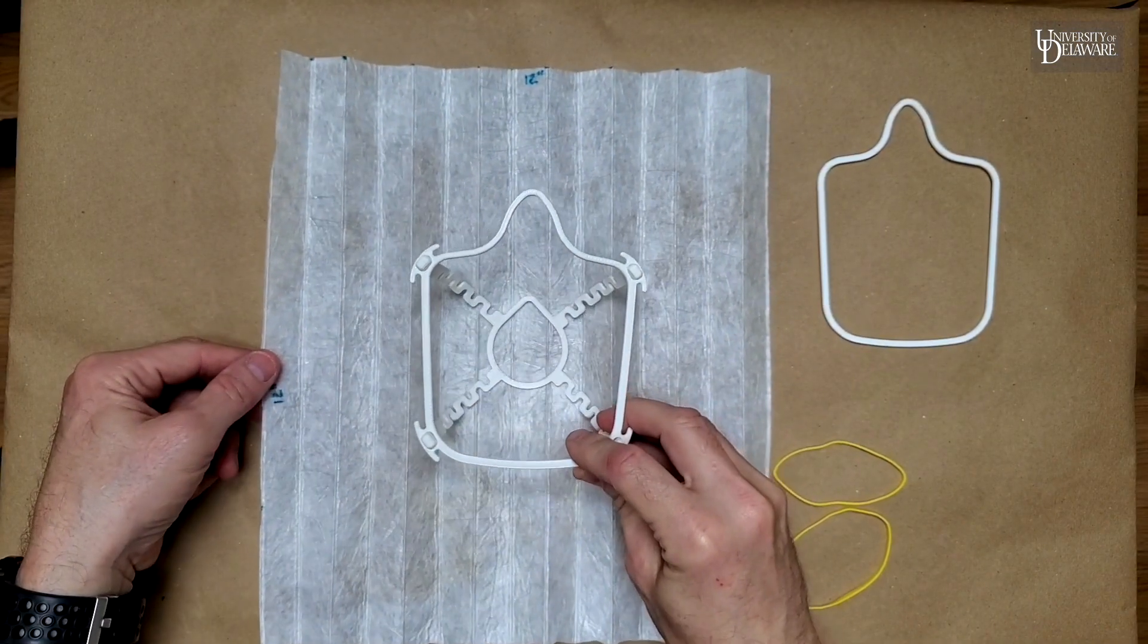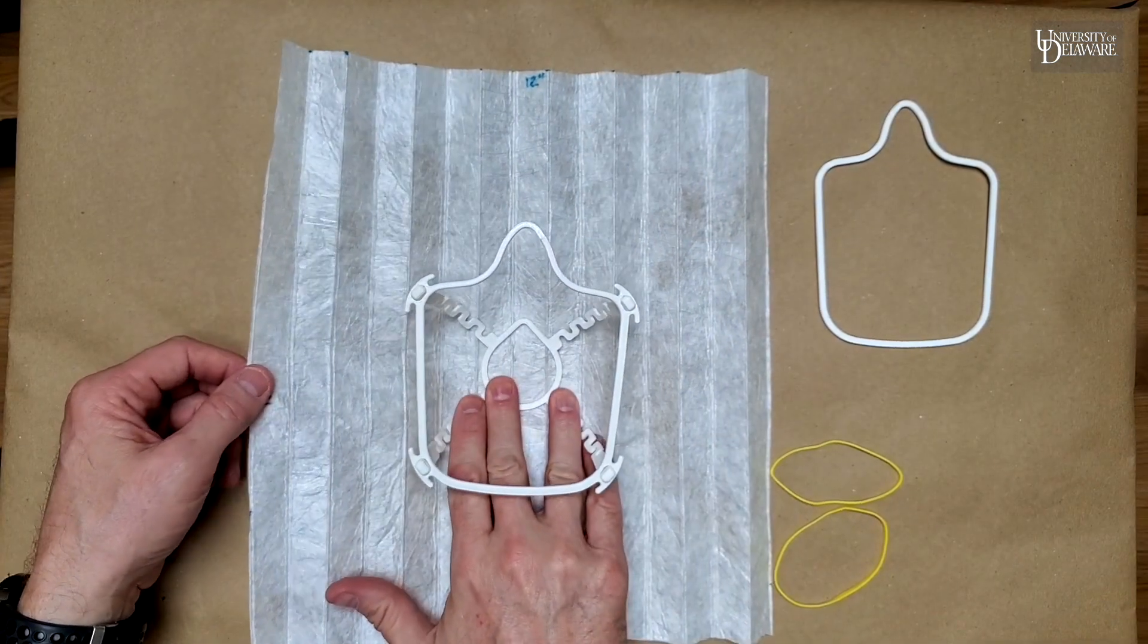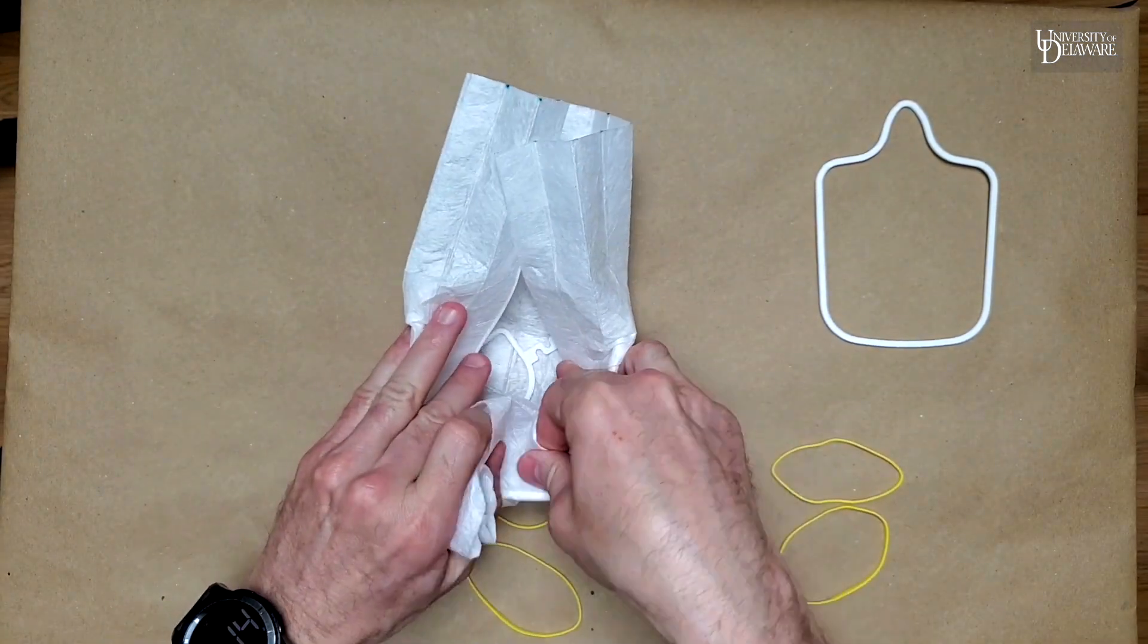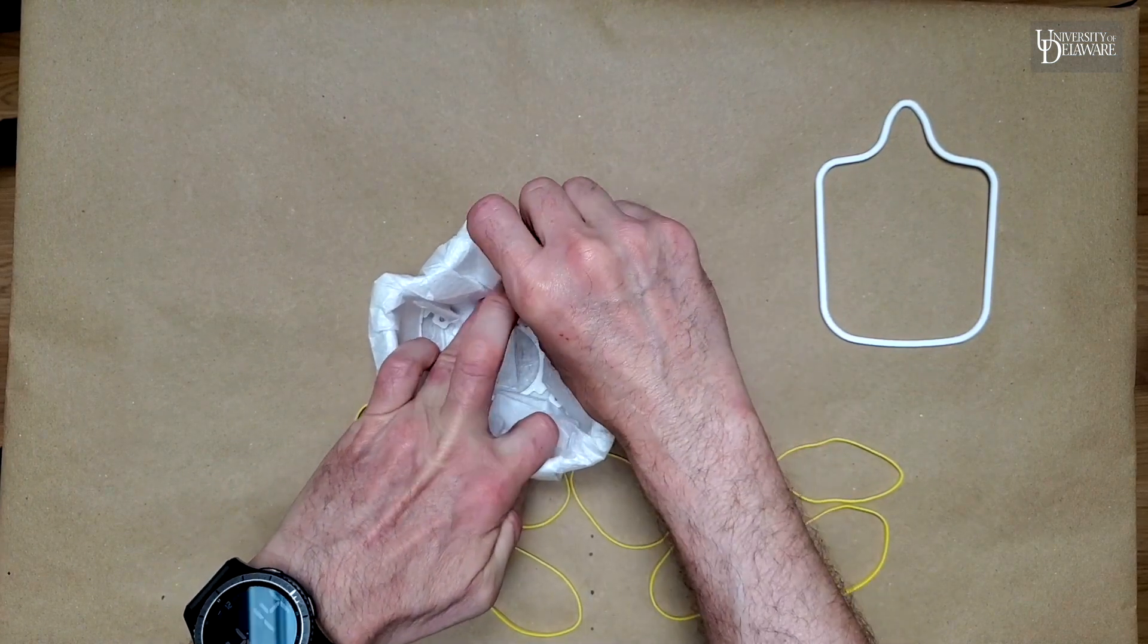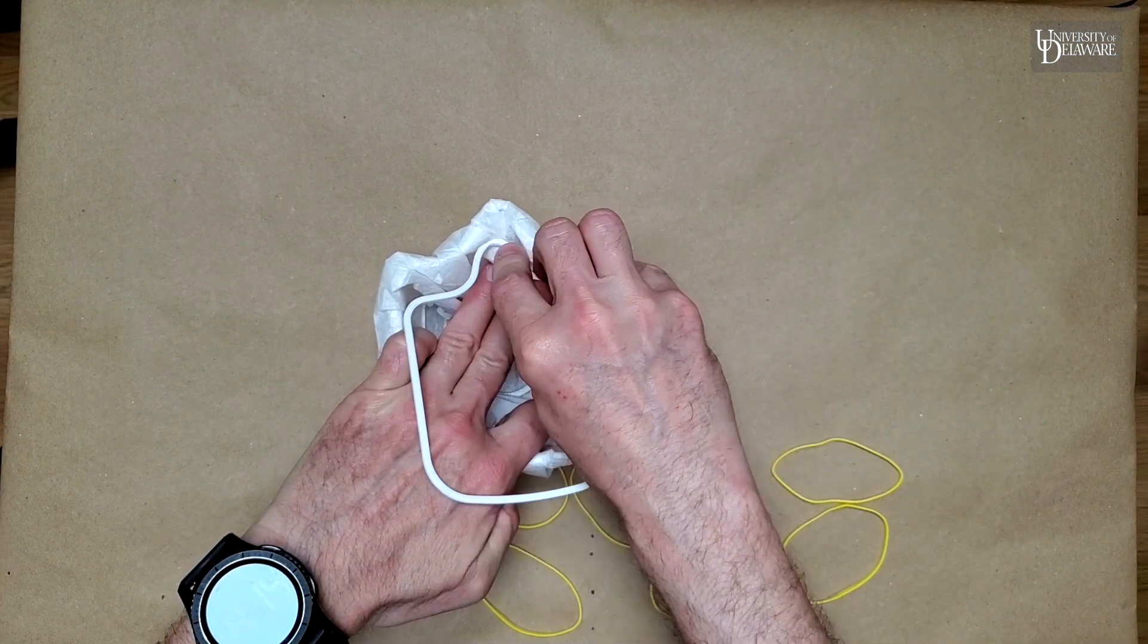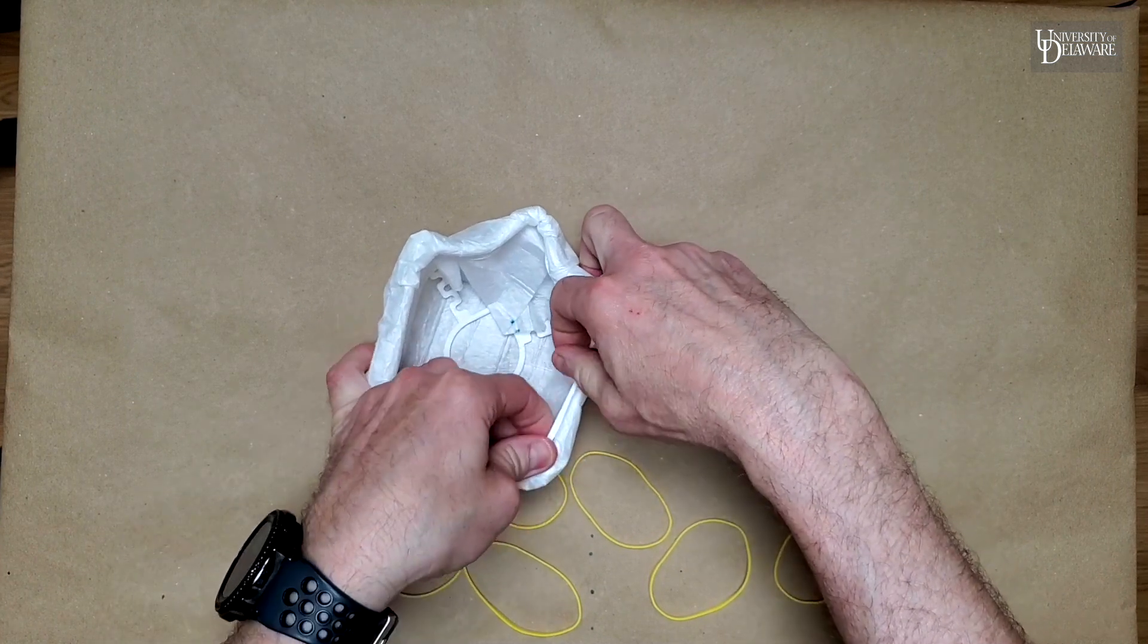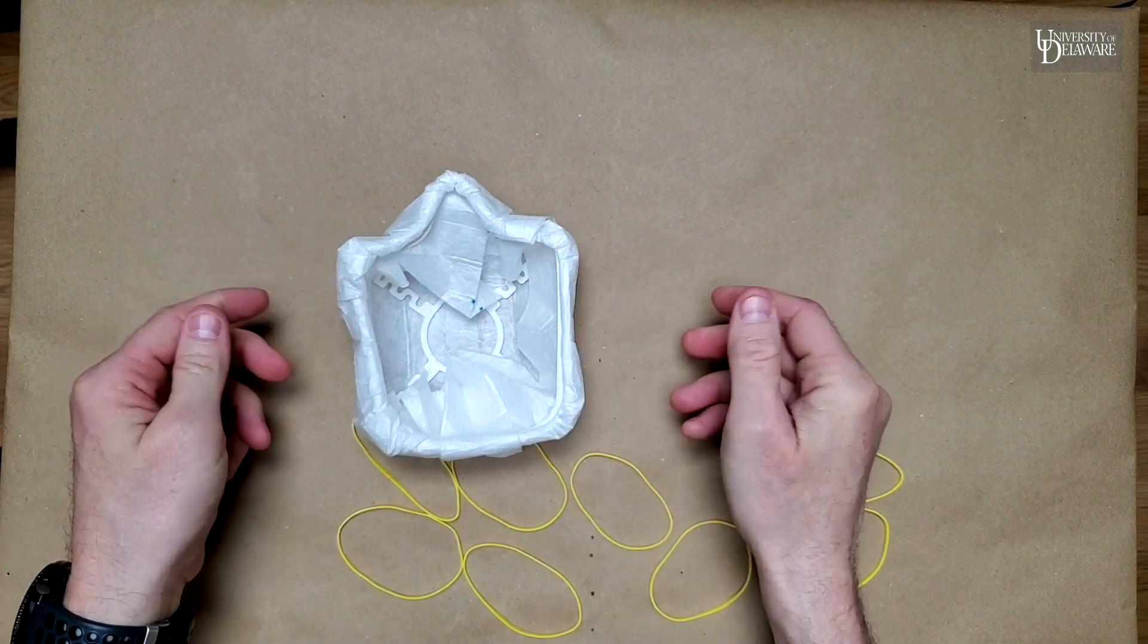Take your 12 inch by 12 inch swatch of filter material. Place your assembled frame in the middle. Start folding it over like you're wrapping a package. Once everything is folded over like this, take your containment hoop. Tuck it underneath. Just press it into place until it snaps underneath of the frame, like this.